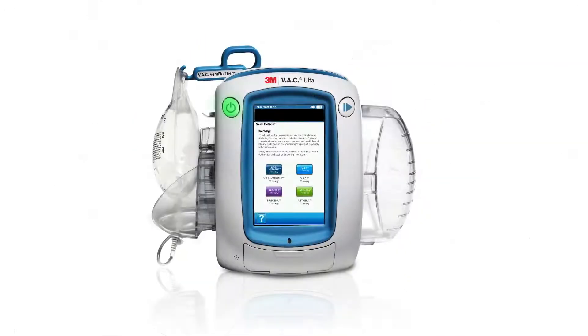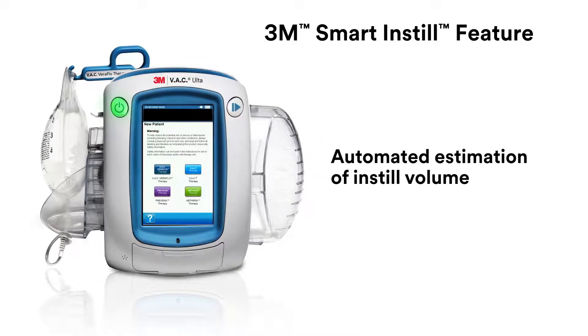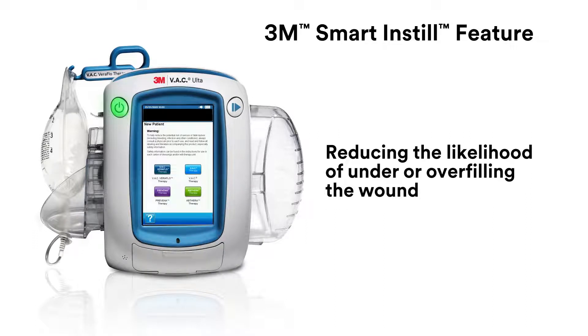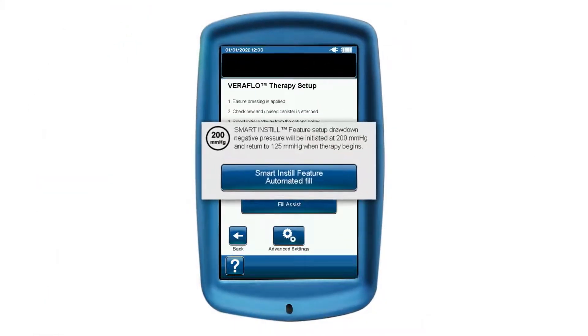The Smart Instill feature provides a suggested fill volume to streamline initiation of VeriFlow therapy, allowing you to confidently apply VeriFlow therapy and reducing the likelihood of under or overfilling the wound. Select the Smart Instill feature when you select VeriFlow therapy on the home screen of the VAC Alter Therapy unit.